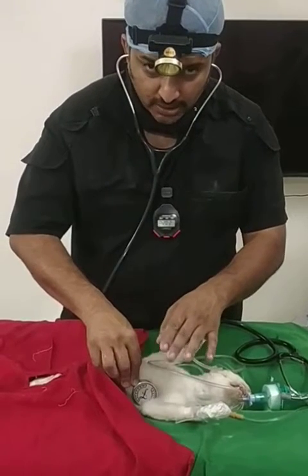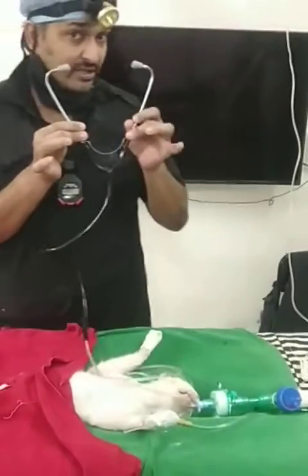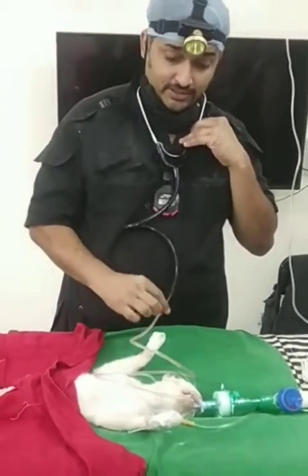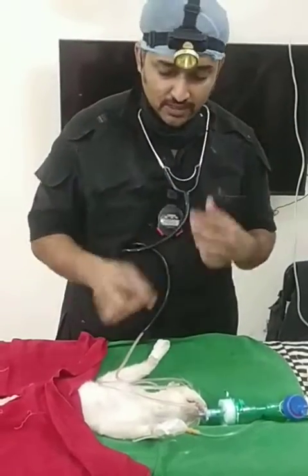I'm basically assessing the quality of the heart sound, because what I have here is a makeshift esophageal stethoscope. This is an ordinary stethoscope, and this is a Ryles tube that I have connected over here. It has a radiopaque bead inside, a radiopaque line, and openings so that it doesn't get clogged with saliva.